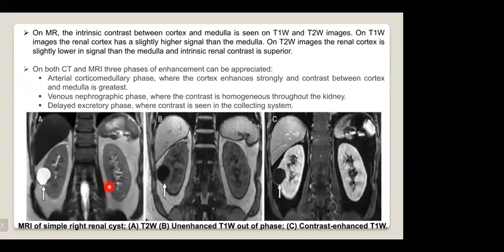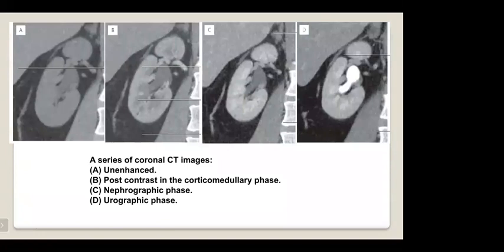This is an example of MRI of a simple renal cyst on T2-weighted images, enhanced T1 out-of-phase, and contrast-enhanced T1-weighted images. A series of coronal CT images is shown: unenhanced, post-contrast corticomedullary phase, nephrographic phase, and urographic phase.